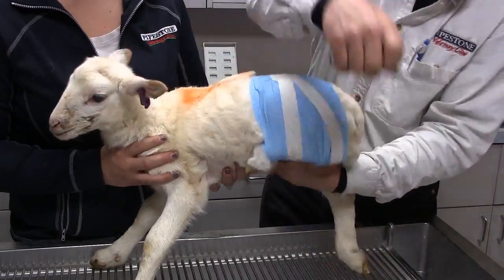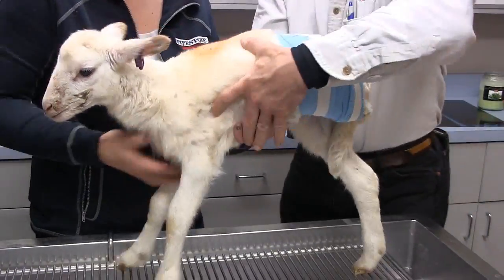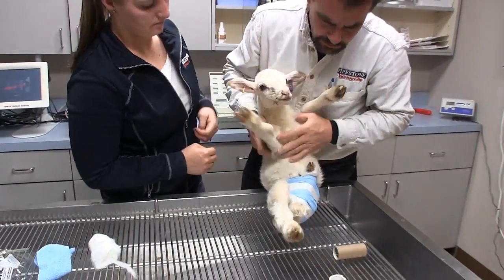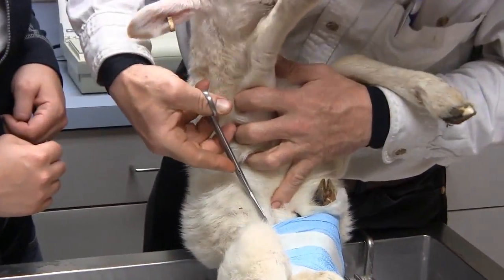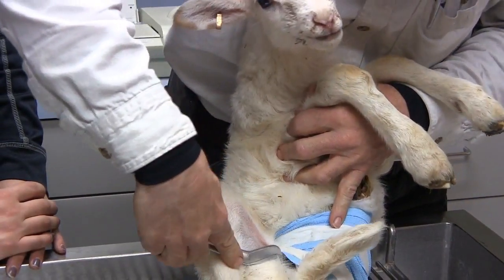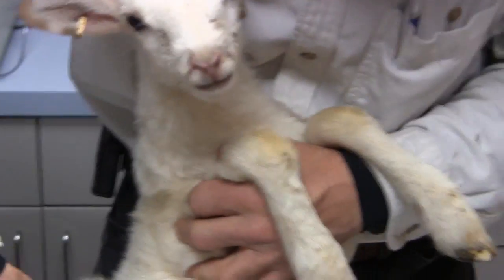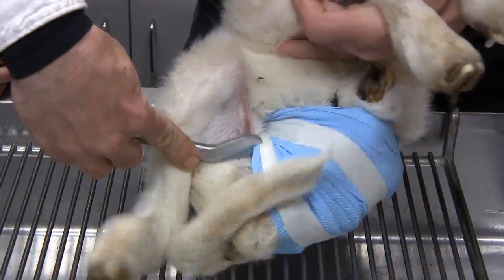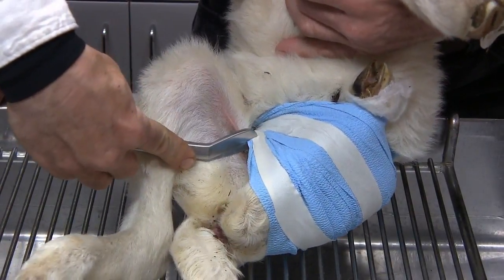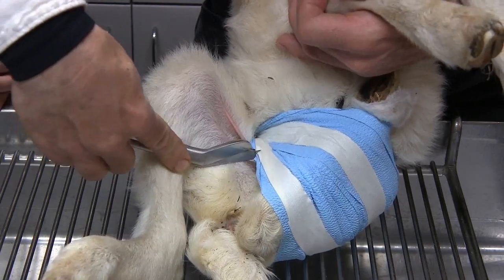Now we're going to go ahead and flip the lamb over, and if it's a male lamb, we need to cut just a little bit of the wrap away so we can make sure he can urinate. Also, sometimes this gets extremely tight by the flank of the lamb, so we may want to take a scissors and just snip a little bit of the vet wrap to allow just a little more movement to the other limb, but yet still securely hold the fractured limb in place.